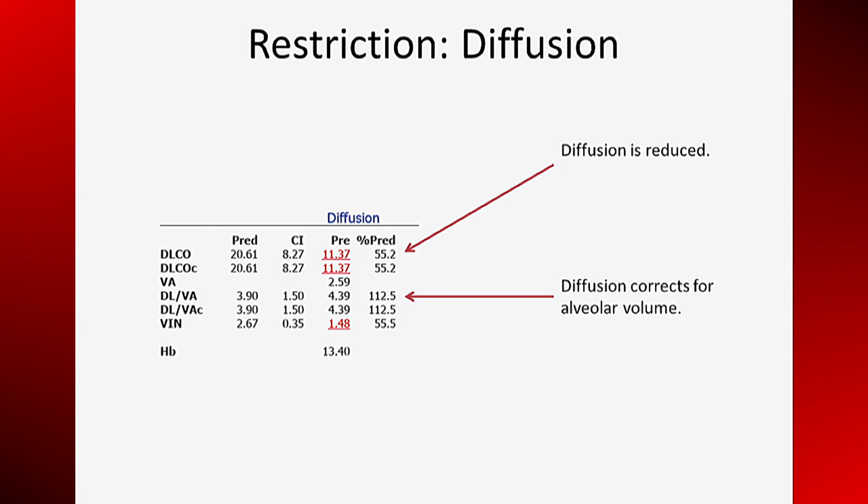volume. I have not found this distinction to be very helpful in clinical practice, but one should be aware of it. This concludes Lecture 3.